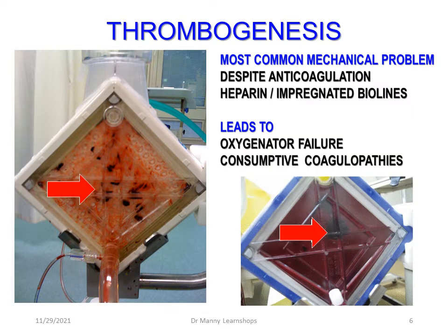Another potential problem is thrombogenesis. And it's probably the most common mechanical problem despite anticoagulation and heparin-impregnated circuits. And this could lead to oxygenator failure or consumptive coagulopathies such as DIC.